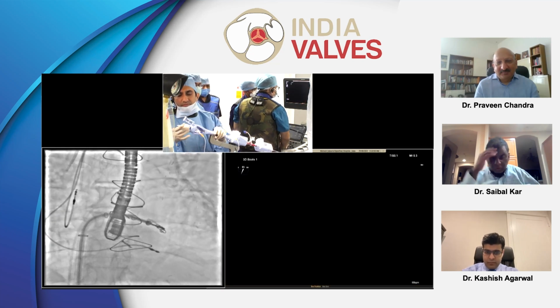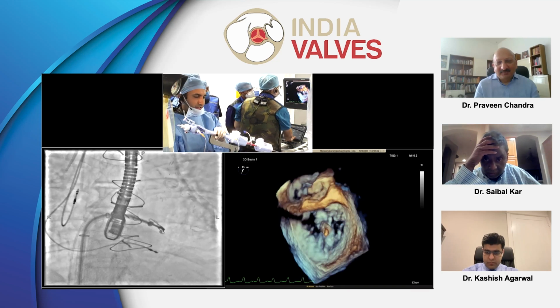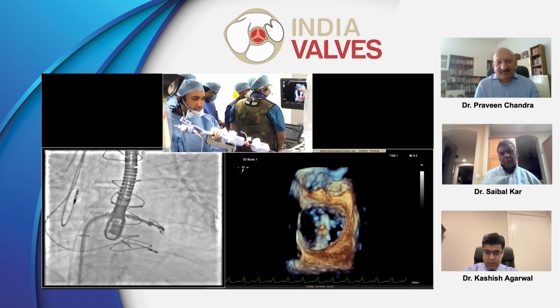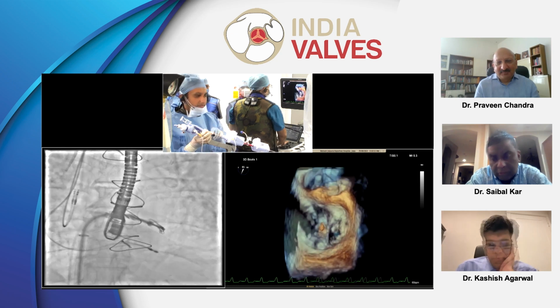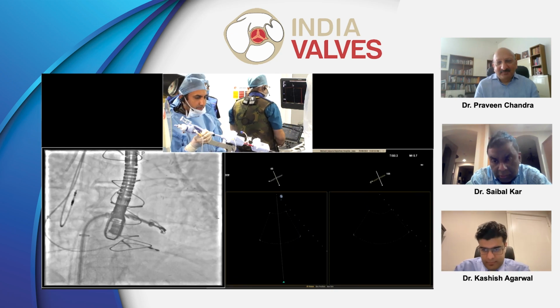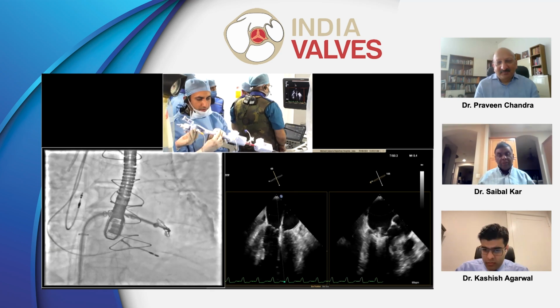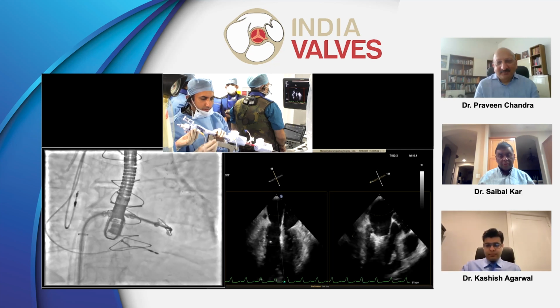Lost the orientation. Let me see. Orientation is, I think we are okay. 12 to 6. Okay, yeah, sure. But we have come more posterior. Grasping view, please. Pull the system or get a little more. So I'll just pull. Tiny. I'll pull back the system a little.